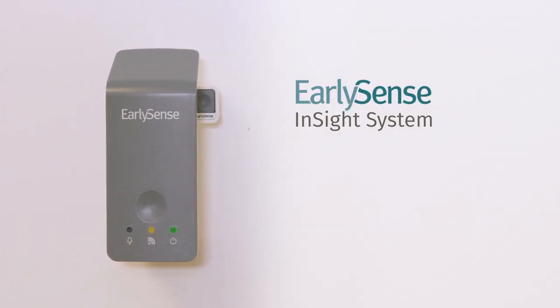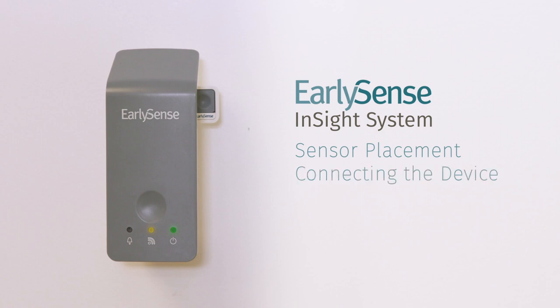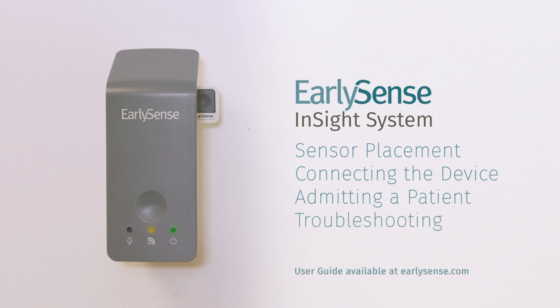Welcome to the EarlySense tutorial video. This video will cover placement of the EarlySense sensor, connecting the InSight device, admitting a new patient, and basic troubleshooting. For additional information on how to operate the EarlySense system, please refer to the relevant user guide provided upon installation or online at earlysense.com.